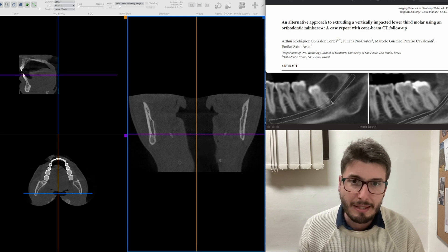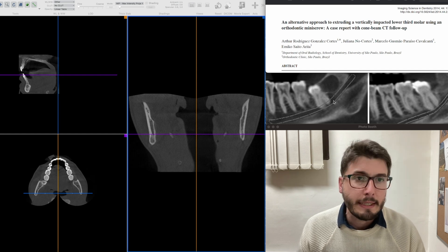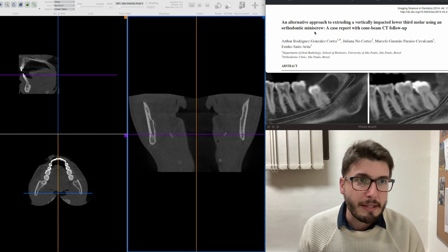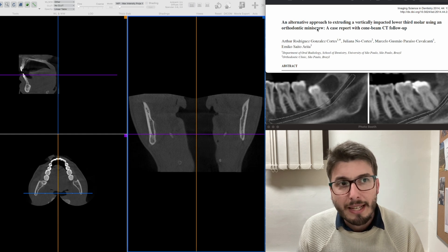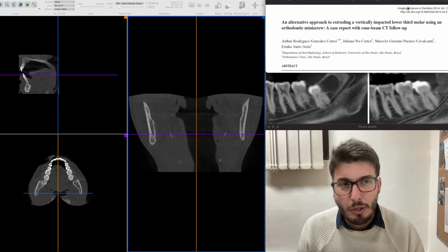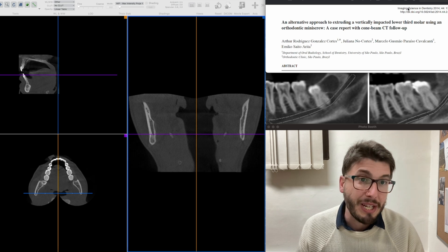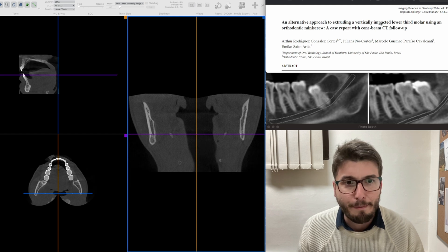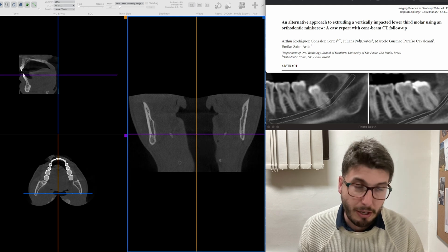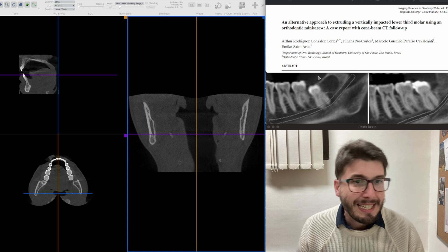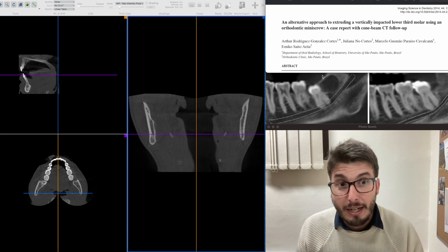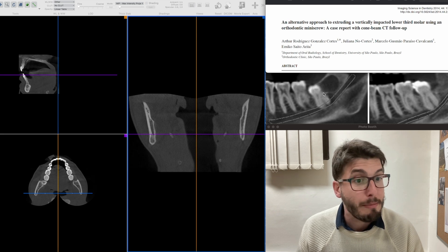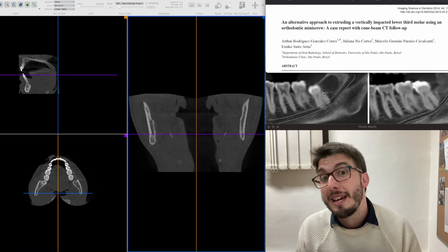I am recommending an article published by myself in the Imaging Science in Dentistry journal. It is from 10 years ago but still valid for learning how to plan the surgical extraction of a lower third molar. In this case there was a lesion — a hypodense lesion in 3D — associated with the third molar.